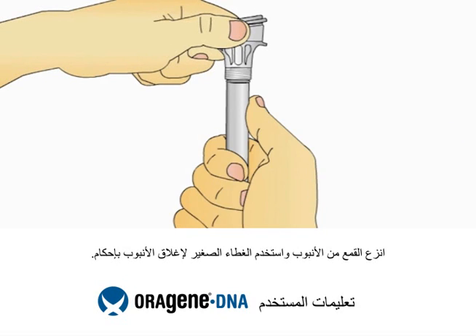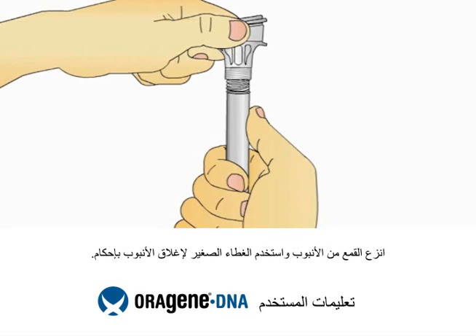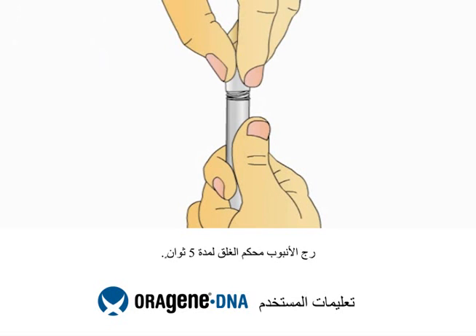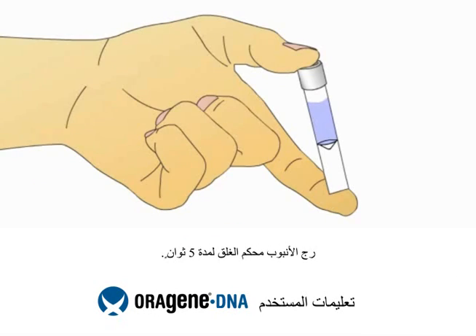Hold the tube upright. Unscrew the tube from the funnel. While keeping the tube completely upright, pick up the small cap and use it to close the tube containing your sample.